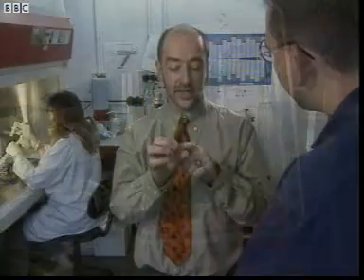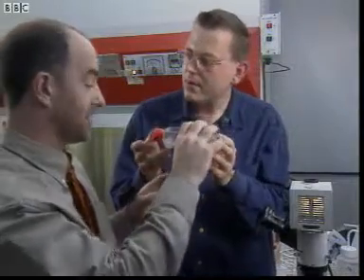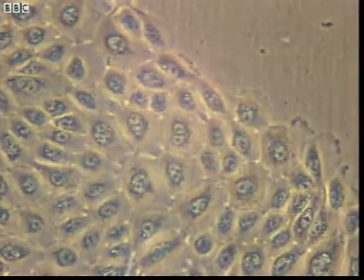Well, for example, if we took a 1p piece of skin, we could separate the keratinocytes out into culture dishes, and we could, in theory, grow sheets of skin to cover an adult human in 3 to 4 weeks from a 1p piece of skin. That's amazing. So this is the medium they're grown in? No, there are actually 4 million cells in here. How small are they? Well, you could fit 400 of those cells on the head of a pin.